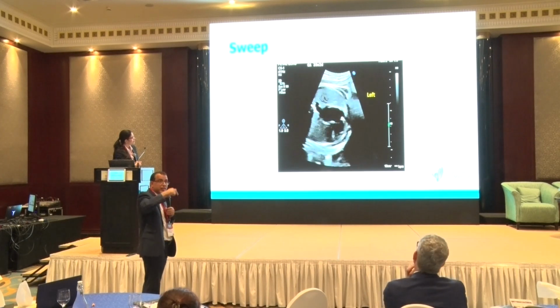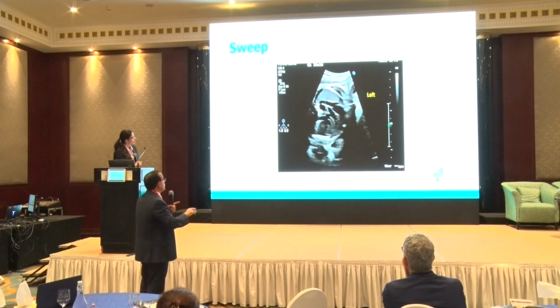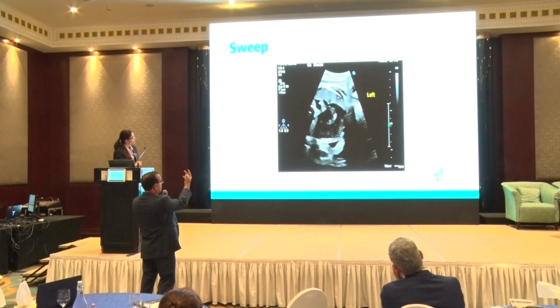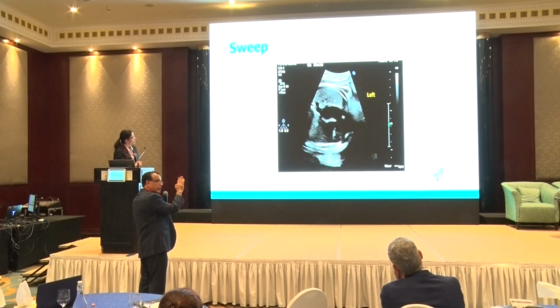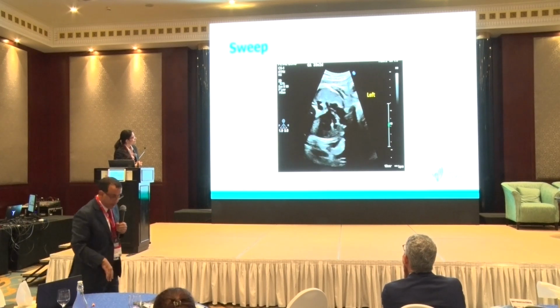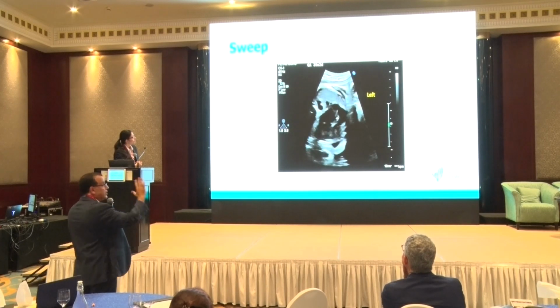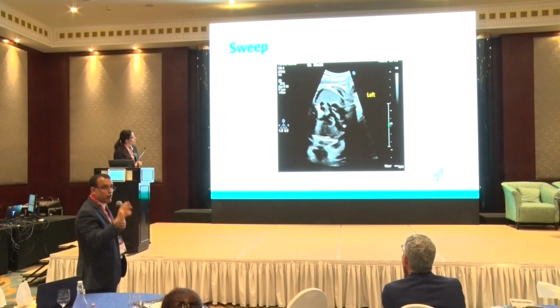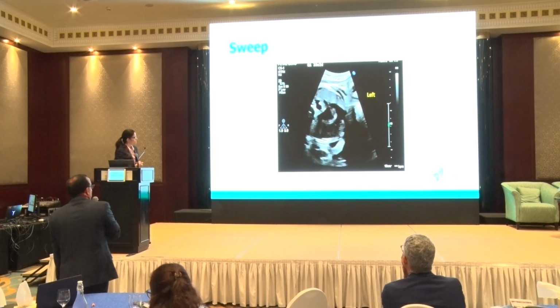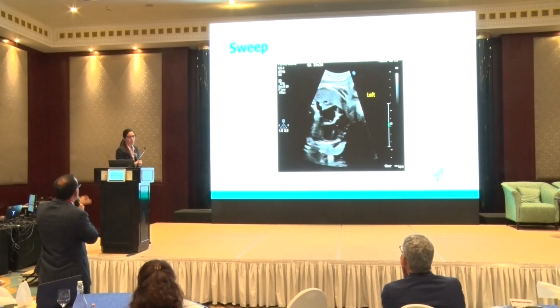I should see the aorta first, if it is a normal relation. So probably if you manipulate a little bit, you will see both of them at the same level, but we are probably angling in some format. So we are not seeing them together at the same level. The first one to see the pulmonary artery branching nicely, that's a transposition until proven otherwise, a form of transposition. And this is probably a form of double outlet right ventricle, with small arch.